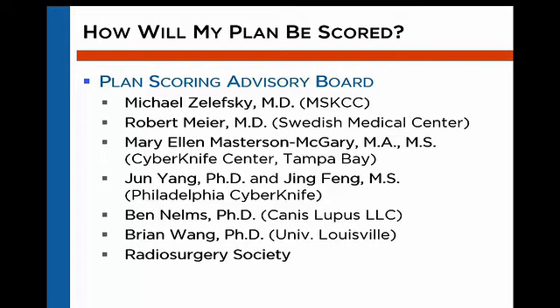Actually, it was a series of 3 meetings with this task group to come up with a process to determine which metrics we think are important and how to score each metric, so that we can really learn and have a very challenging set of metrics where we can learn about what's possible to deliver to this type of case.